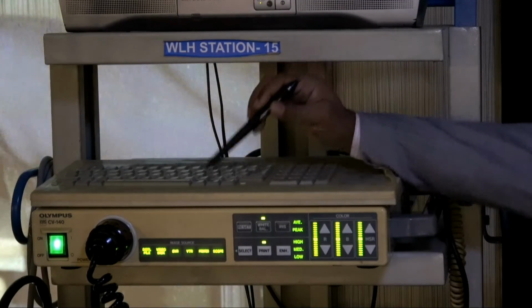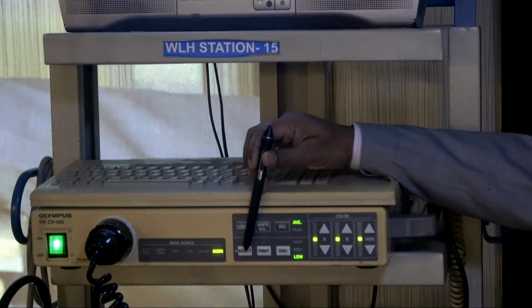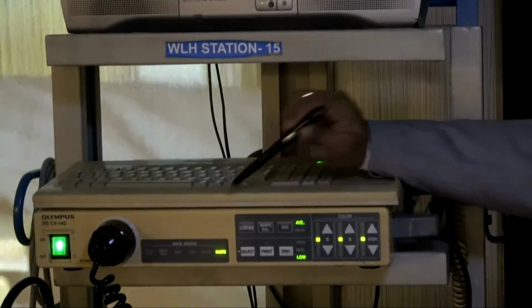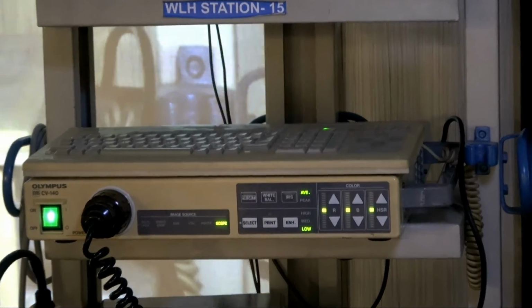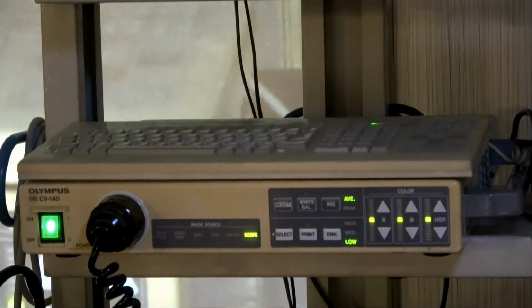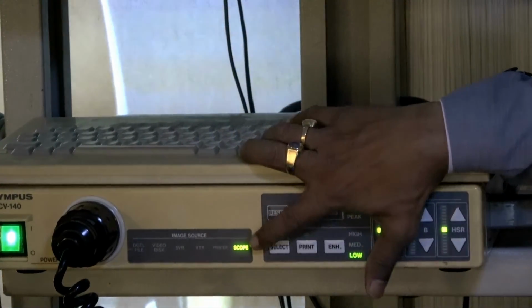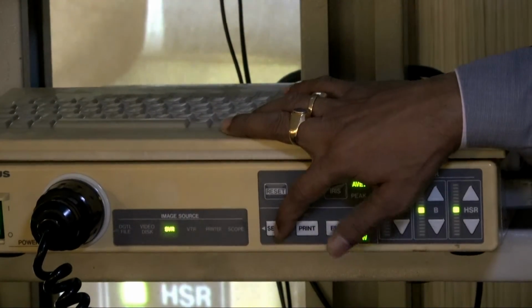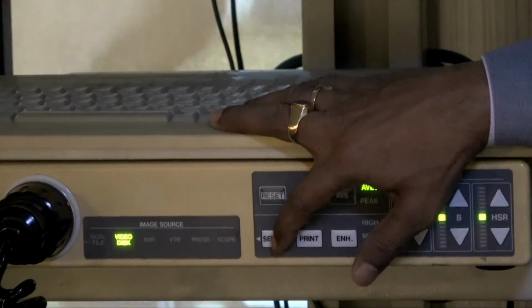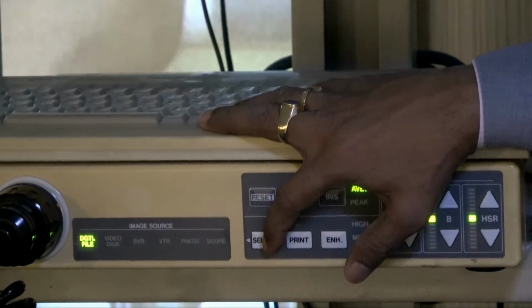So here, focus a little more. This is to select your data source. In video endoscopy, it is necessary that you give the data to the patient. You need to give the video of the endoscopy or at least a picture. If you see here, this is a scope, this is directly going to the printer. This is the video tape recorder. This is the S video recorder. This is the video disc. And this is the digital file. It has its own digital file.